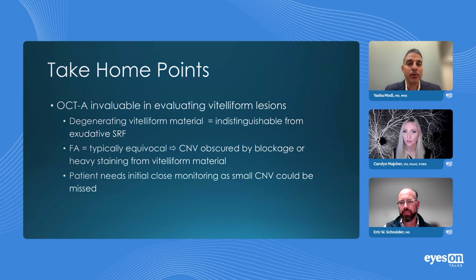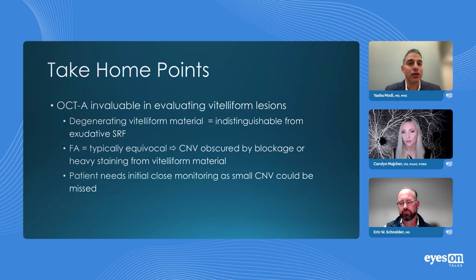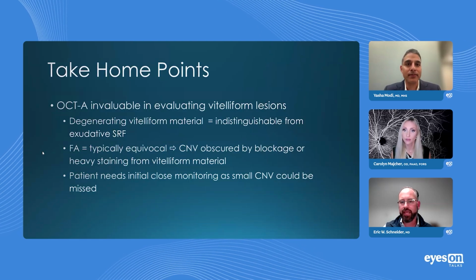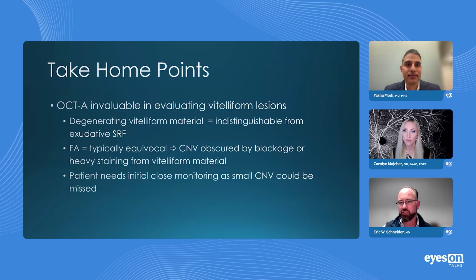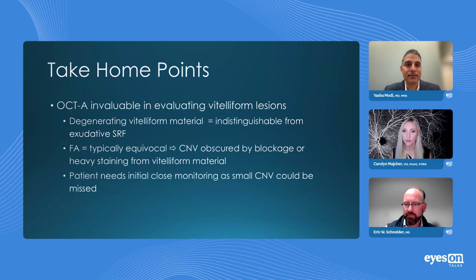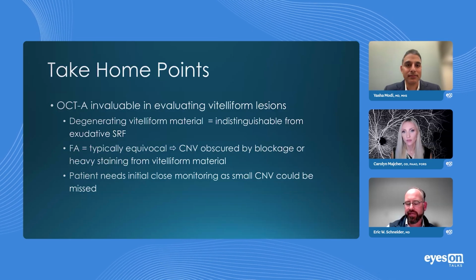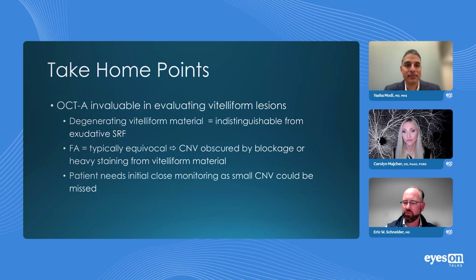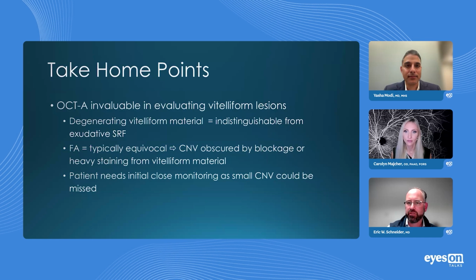Eric, maybe can you talk to us through when you're examining somebody, are you going through the entirety of the cube and then are you going back and getting OCTA, or is that just sort of like a default strategy? Yeah, to be honest, I'm obtaining OCTA in most of my patients who I think have a potential either outer retinal exudative disease or retinal vascular disease. I think that it's incredibly valuable, and I'm oftentimes learning more, and it's sort of augmenting my structural OCT analysis.